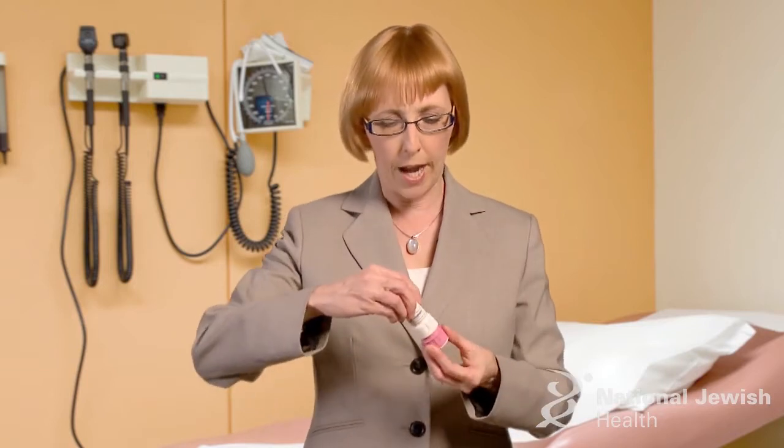If you were instructed to take another dose, you would put the cap on, twist the cap off, and do that again. After you take the dose, wipe the mouthpiece dry if you need to. Replace the cap by twisting it to the right.